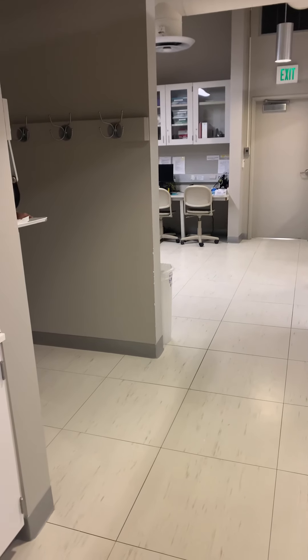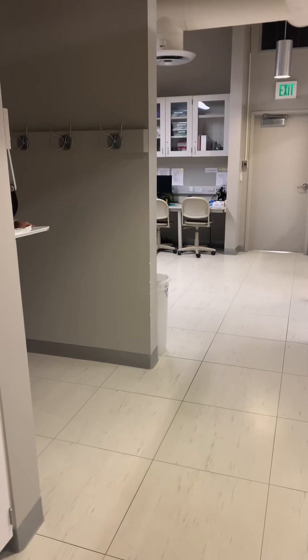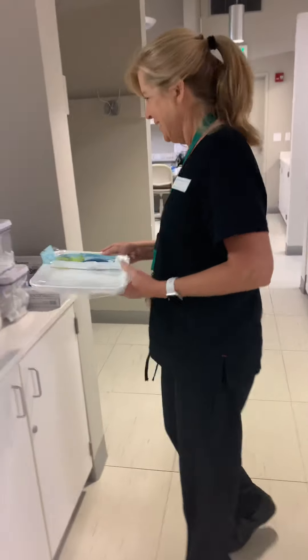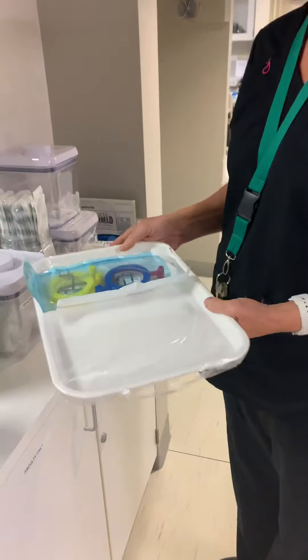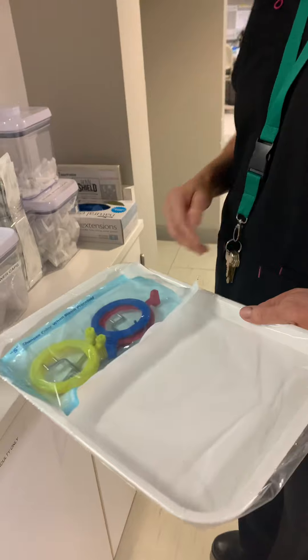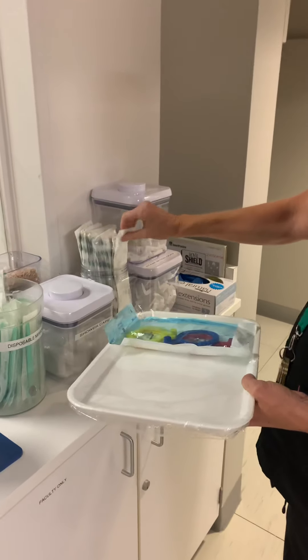We are going to do x-ray room setup. Professor Monk is coming around with her tray. She's already performed hand hygiene in our sterilization area. She has her tray with her x-ray holders and she's going to grab her barriers.